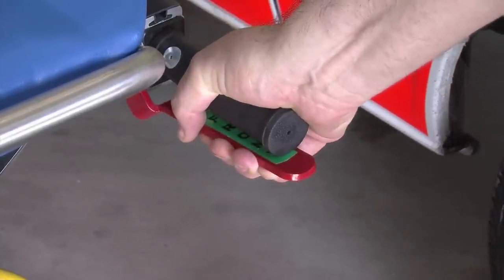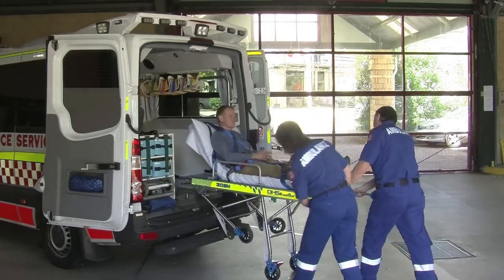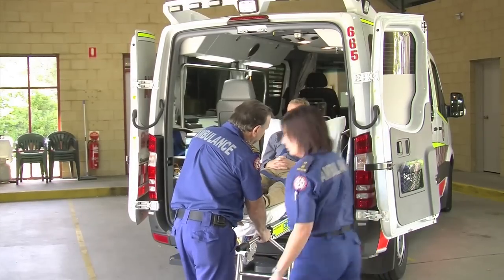The single action of lifting the right hand front leg release lever will allow you to push the front half of the 305N smoothly into the vehicle. Remember to check that the front wheels have dropped into position.